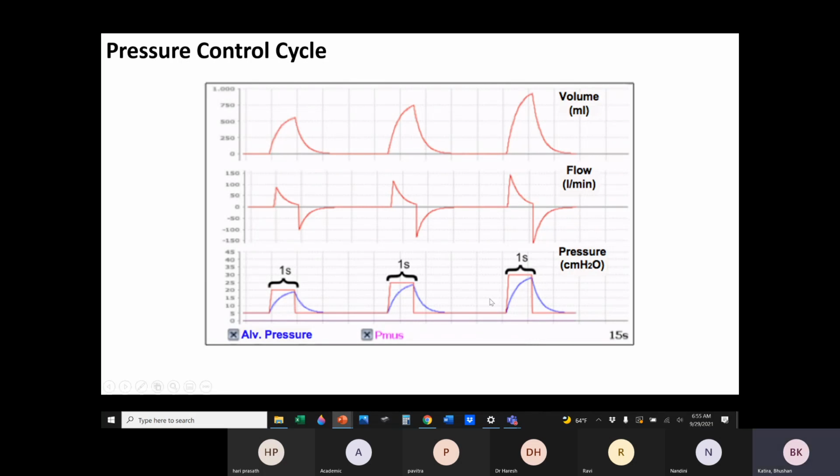All right, and that makes sense because the pressurization or the difference between the two pressures is at a similar time point. If you go for example to 1.5 seconds, then for almost 0.5 seconds the alveolar and the airway pressure will be same, and you will have a kind of an inspiratory pause or a flow zero condition in all three situations.